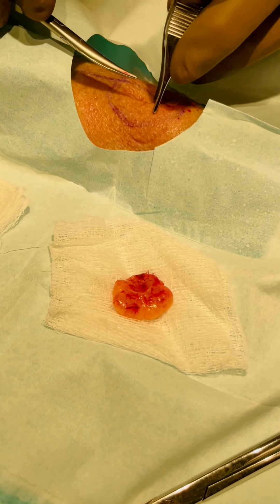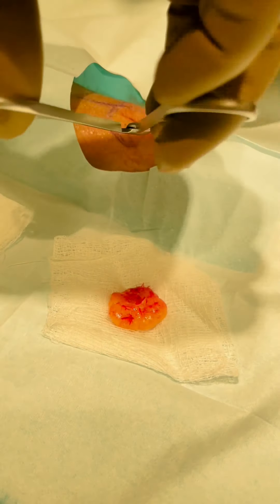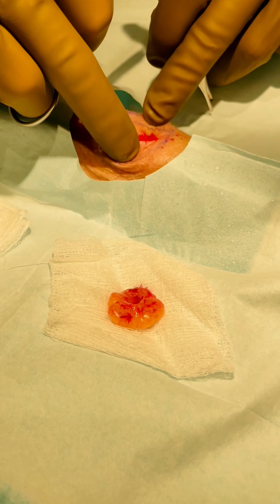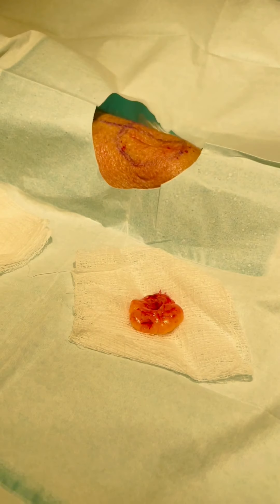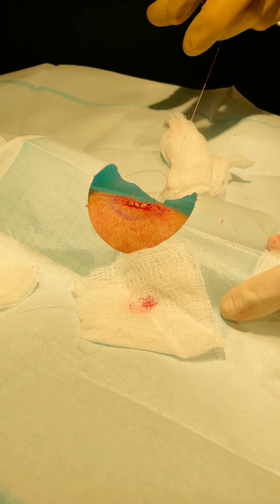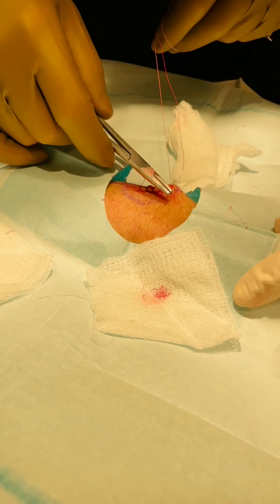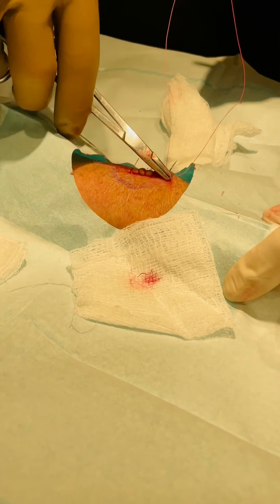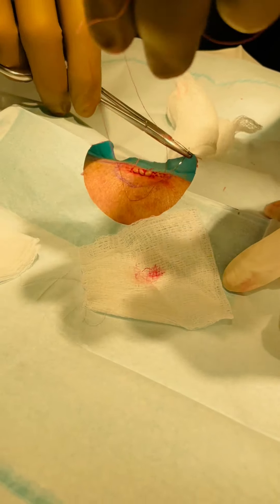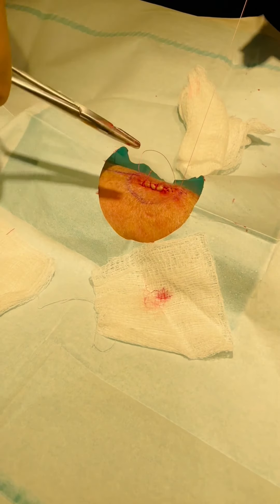Now I'm going to just sort of undermine the area. There is a pocket here, and that pocket will allow me to close it up nicely. So there's the hole - that's for tissue. Put that in the bottle because we're done with it. That must be the last stitch.